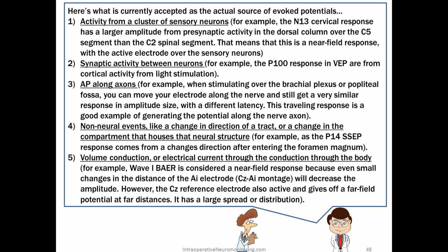But one of those is this non-neural event, like a change in direction. And a fifth way is through what's called volume conduction, or electrical current through the conduction through the body.